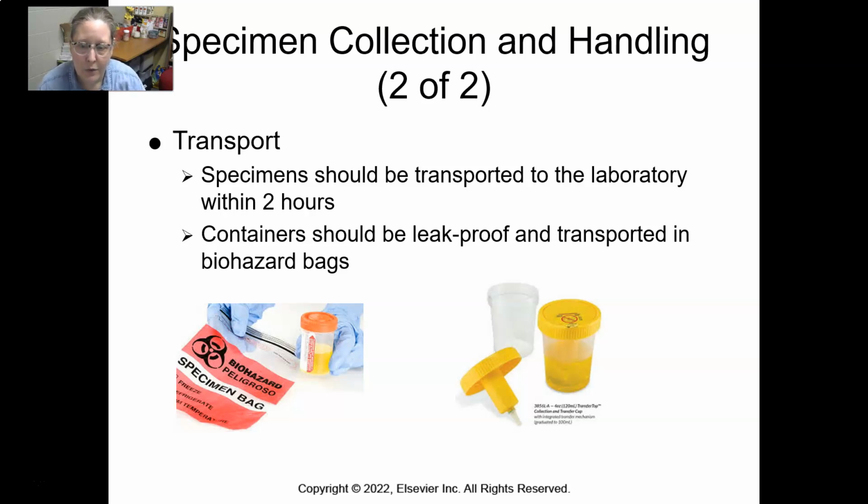The container for the specimen should always be a leak-proof biohazard bag. This is especially important for liquid specimens. Make sure the cap's on there tight. There are some pretty neat systems that have been put out where for liquid specimens like urine, once the specimen is in and the lid is shut tight, you don't have to open it again, and you can access it through this collection port, and it's sterile and it's pretty cool.